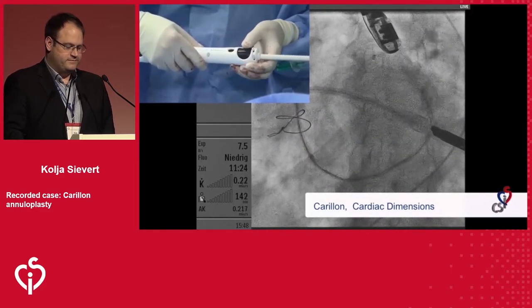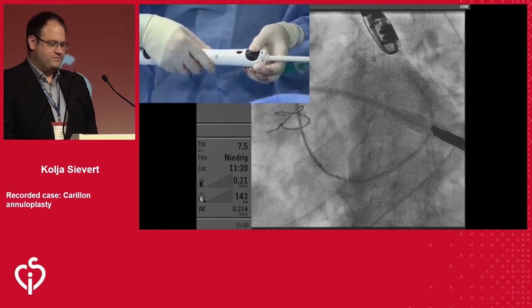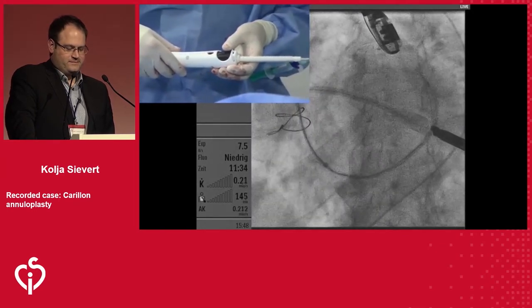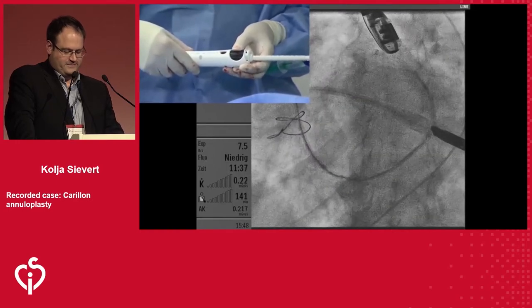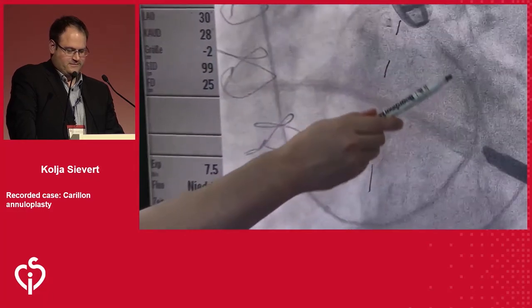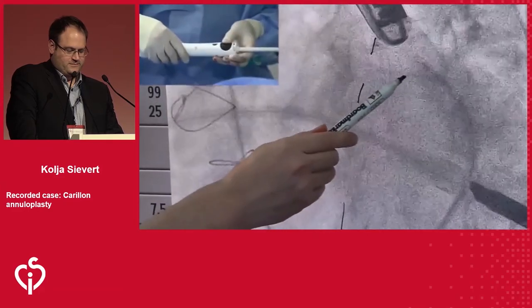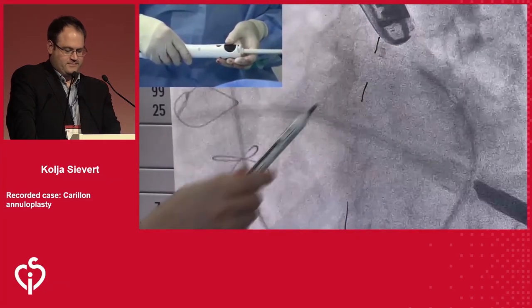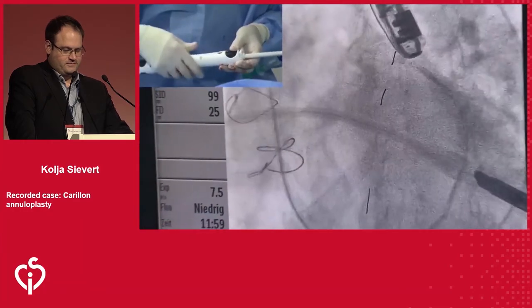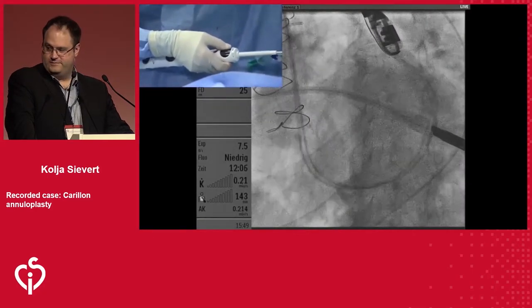So I'm about 2 centimeters away from the tip of the sheath of the guide. Evan, maybe you can point out the distal anchor to them. Yeah. So we can see the distal anchor is collapsed. It's folded inside the 9-French delivery sheath here. The distal anchor crimp tube is right here. You can see that density. And we have about 2 centimeters to go until we get to the end of the 9-French delivery sheath. So the anchor is actually folded within the catheter and will passively expand once it's unsheathed at the tip of the 9-French catheter. Can you show them the proximal anchor crimp tube? Sure. So the proximal anchor is also sheathed, and the proximal anchor crimp tube is down here.